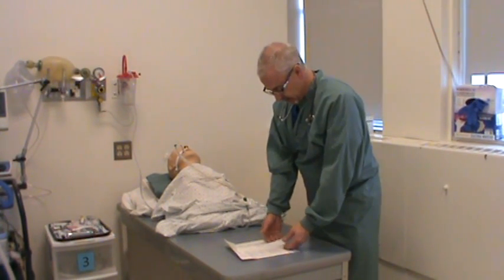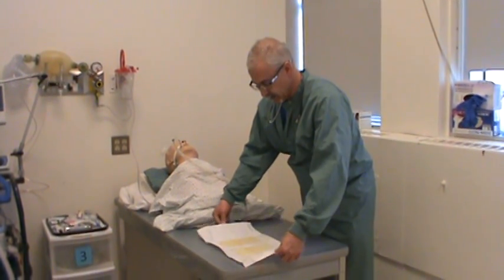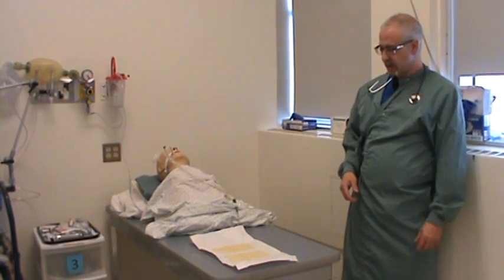Next, I'm going to take my fingers underneath the tabs here and pull this apart like so, so that it stays open. I don't want to talk and spit on there, because that will affect the sterility of the packaging. So the center portion where the gloves are is sterile.